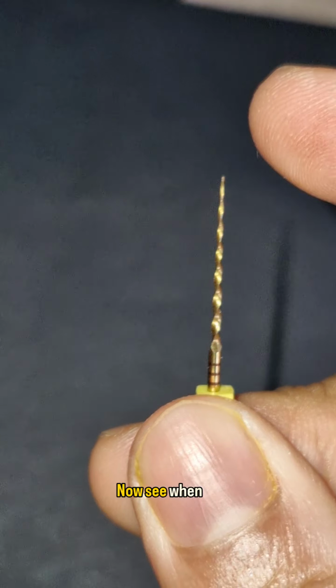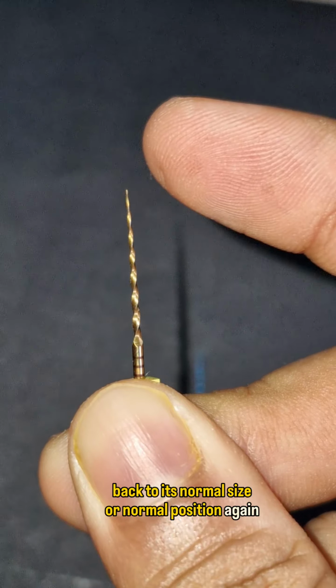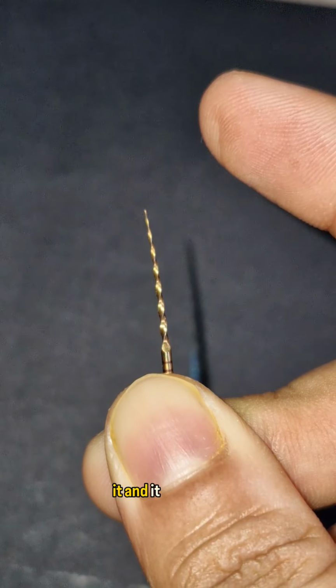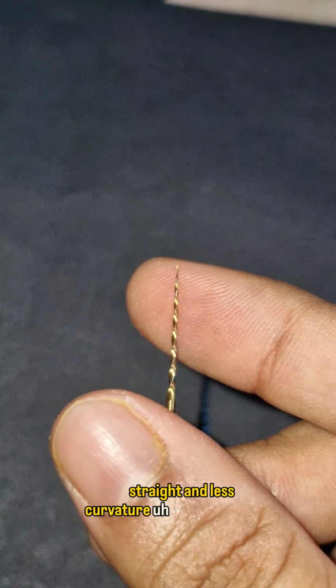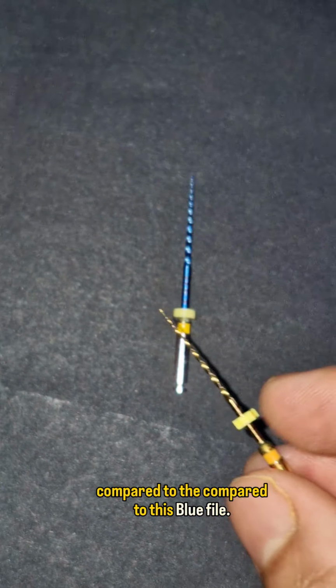Now see, when I try to bend the file, it comes back to its normal position again. This is the shape memory. Now this file is mainly indicated in straight and less curved canals, because this file is more rigid in nature compared to this blue file.